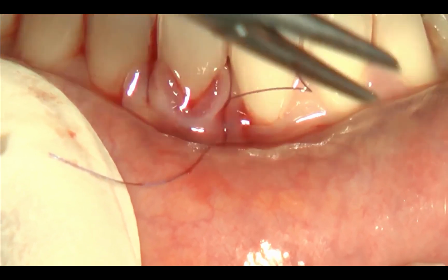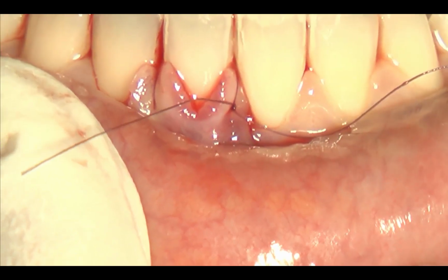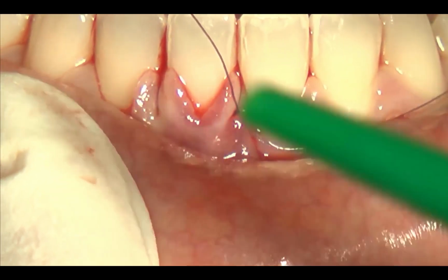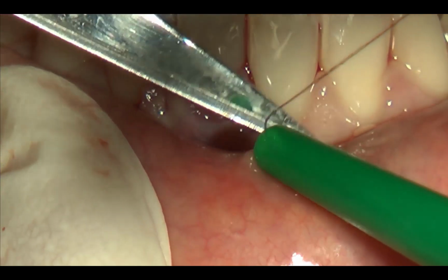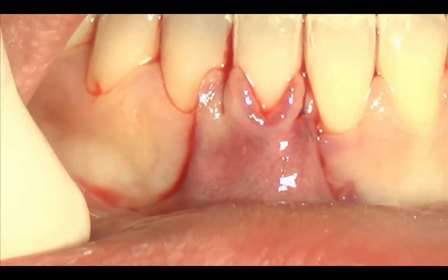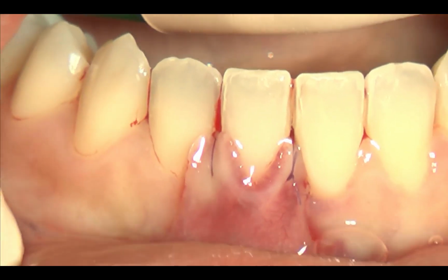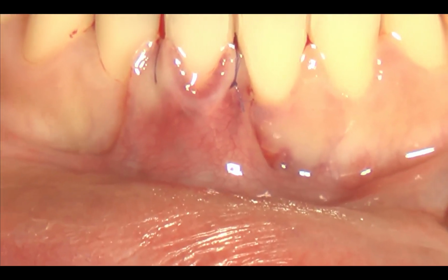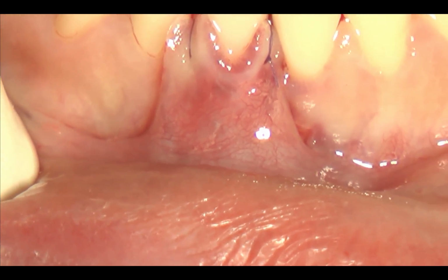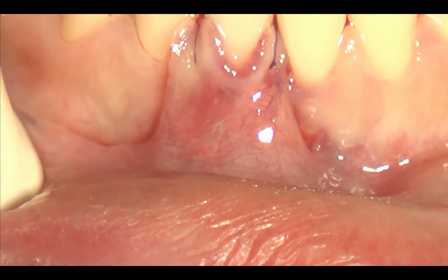Because this suture is very important to allow me to make the suturing along the vertical releasing incision with the papilla in the final position once the lip is very, very close. Now you see that I can pull my lip and I can use again the elastic fibers of the lining mucosa to give verticality to the vestibulum depth. At the same time, the papilla remain in position.